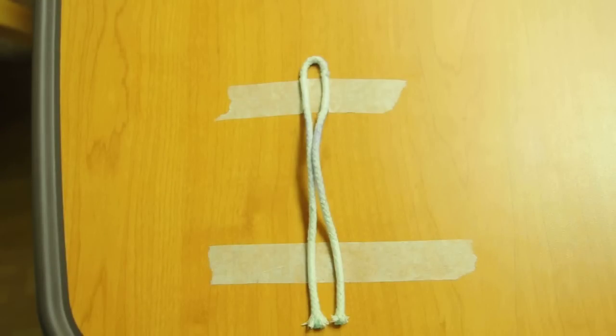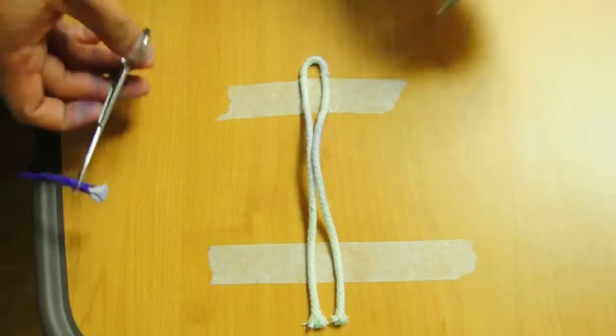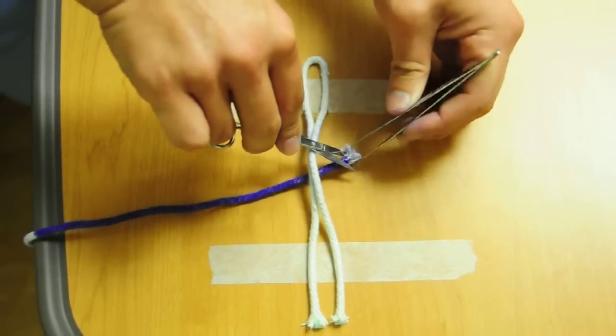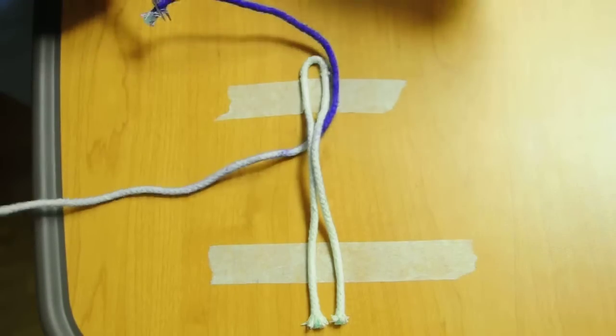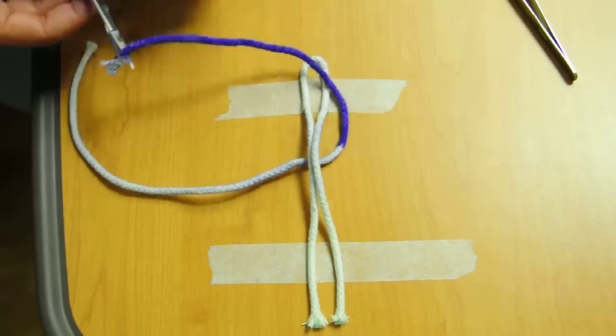So this happens all the time. Say I'm on the attending side of the table. I throw the suture, grab it, pull it through. I'm like, hey resident, why don't you tie that for me? And so now what do you do?